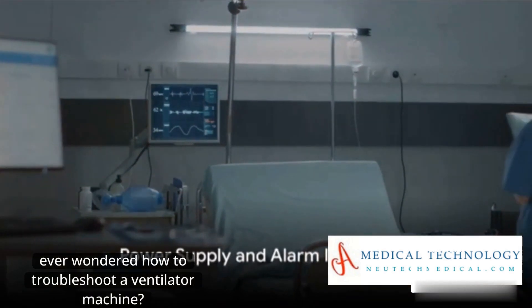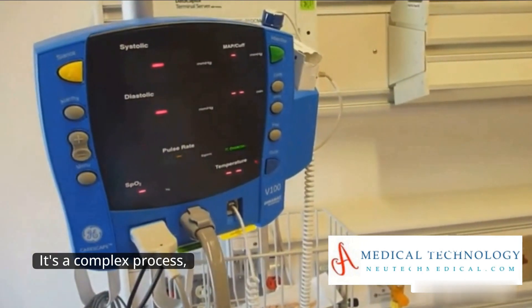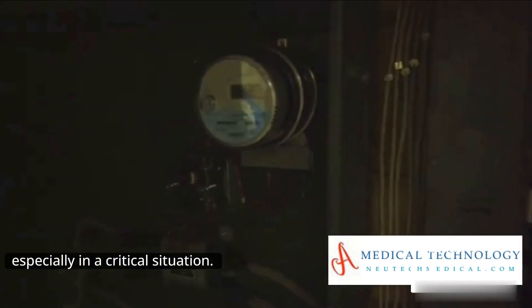Ever wondered how to troubleshoot a ventilator machine? It's a complex process, but understanding some basic steps can prove invaluable, especially in a critical situation.